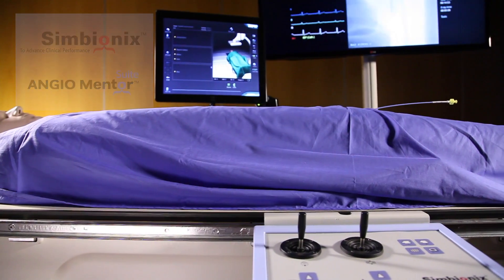Good morning, I'm Robin Williams. I'm an interventional radiologist. I'm going to show you how to do a superior mesenteric artery angiogram on the Symbionic simulator.